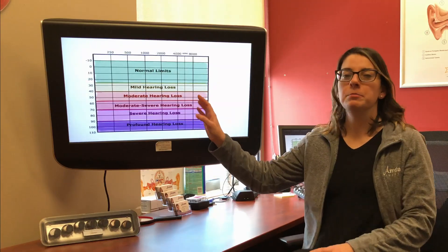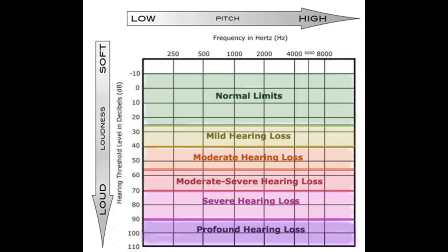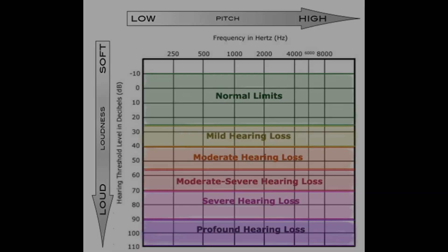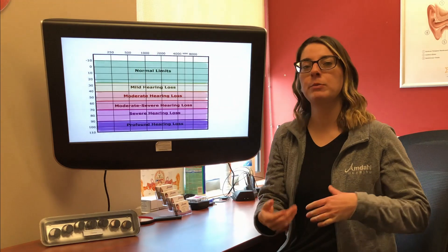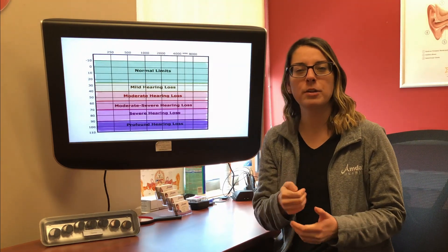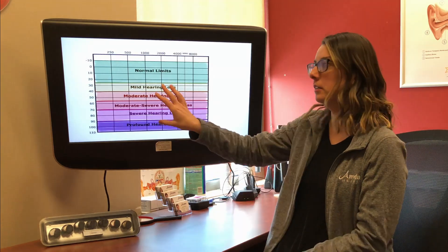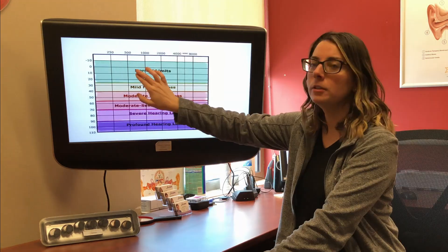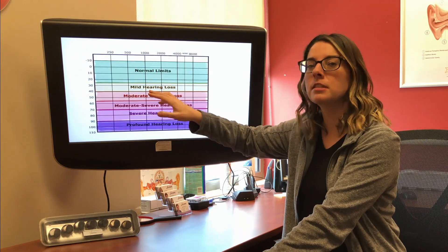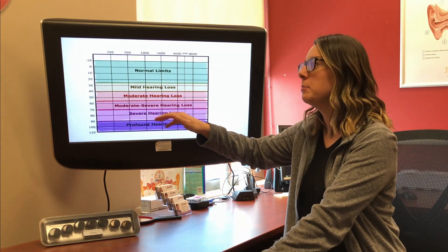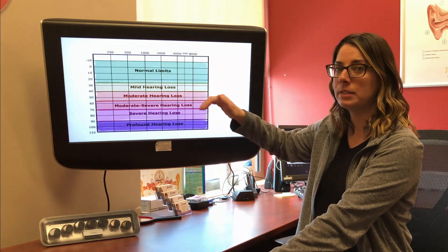So I have an example of an audiogram up here. The way that we read this, it goes from really soft down to really loud, and from low-pitched all the way over to high-pitched. Now when we had you in the booth and you had to press the buttons for all the times you heard those beeps, this is where we mark that on.